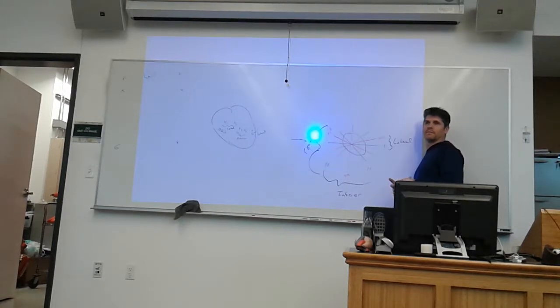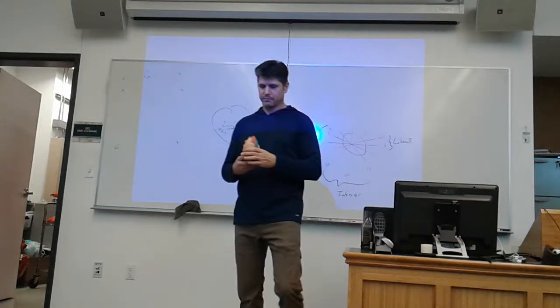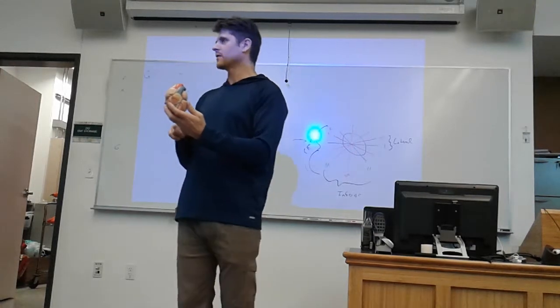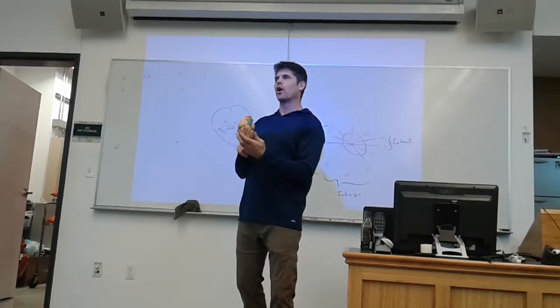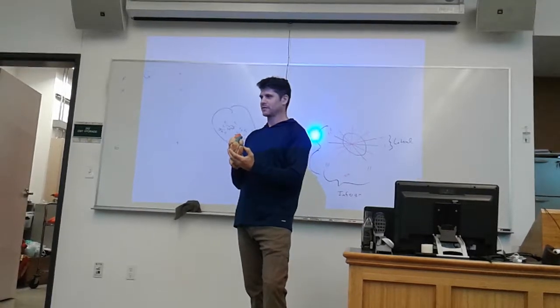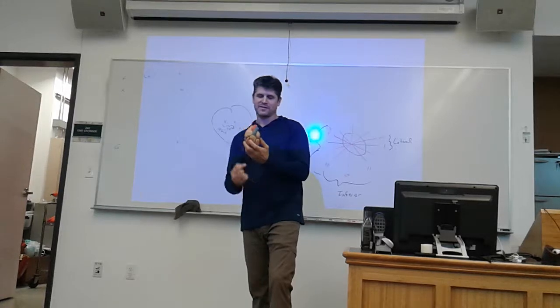V6. The posterior being back here. Which leads might give us the best clue that perhaps something is wrong back there? V6. Okay? I've heard V6 a couple times. V3 and V4? V3 and V4. The inferior leads are all down here, no. Maybe?